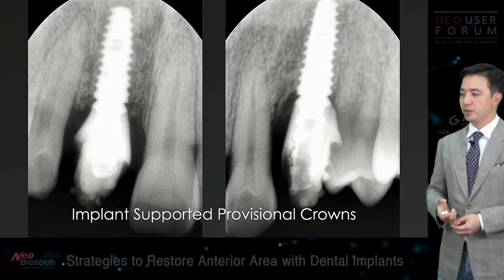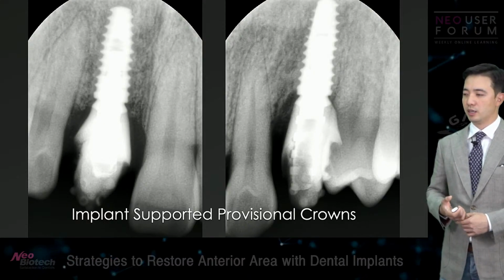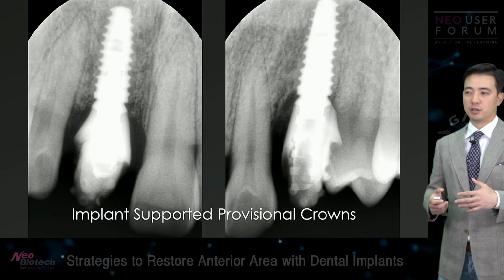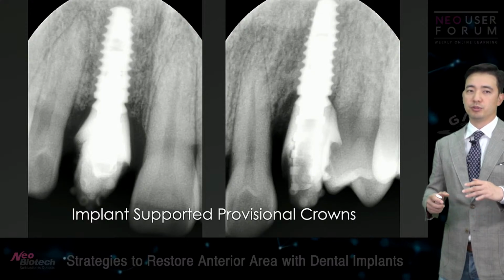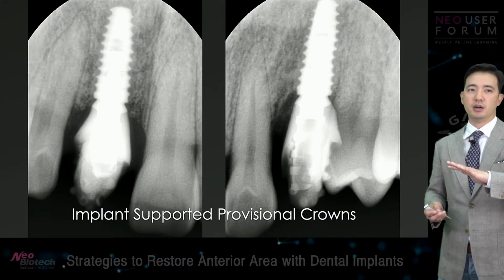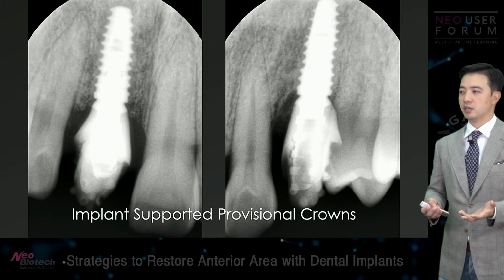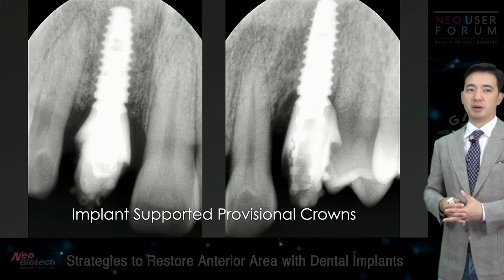So the reason why I use the socket shield technique is because I believe that it best preserves your soft tissue and hard tissue profile, because you're not extracting the buccal part of the root. It's the most minimally invasive condition that you can imagine, right?